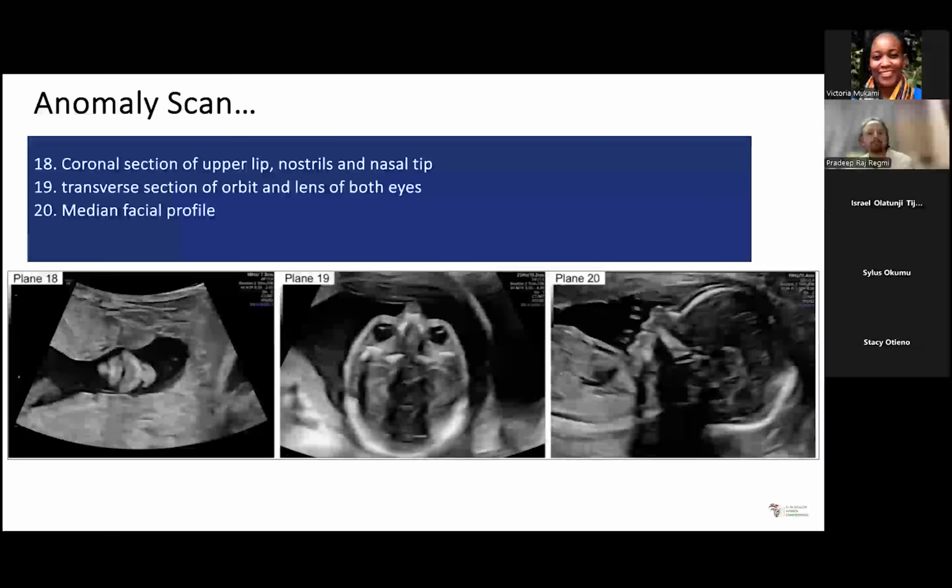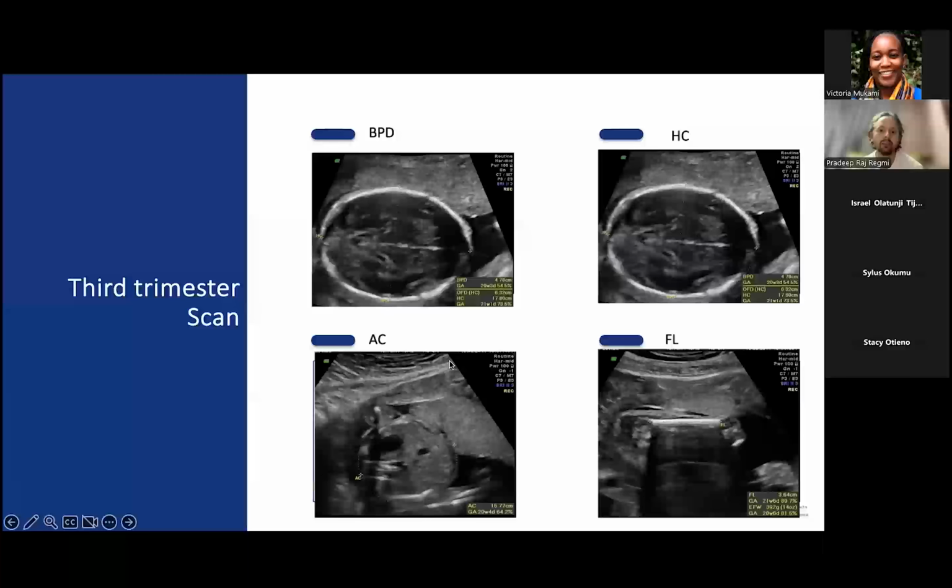So, and these are the fetal look. This is the fetal nose. This is the lips, upper lip, lower lip, and chin. And these are the fetal globes, orbits. And this is the nose, and this is the fetal nose, nasal bone, maxilla. This is the mouth. So we usually scan these for the anatomy scan.